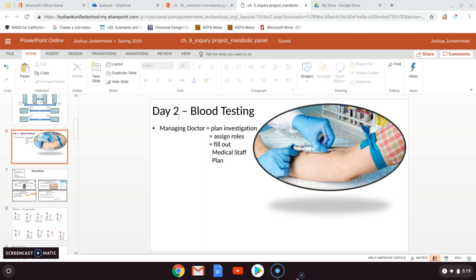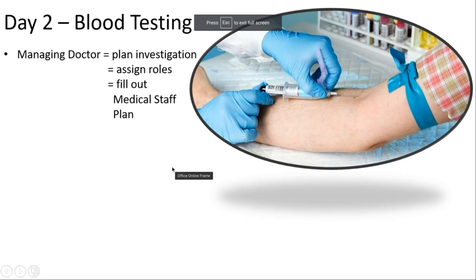So, this video is for our day 2 of blood testing and how we're going to have different people effectively collect the blood and test it of your patient. So it looks nice and big for the screen. All right, so of course, day 2 is blood testing.